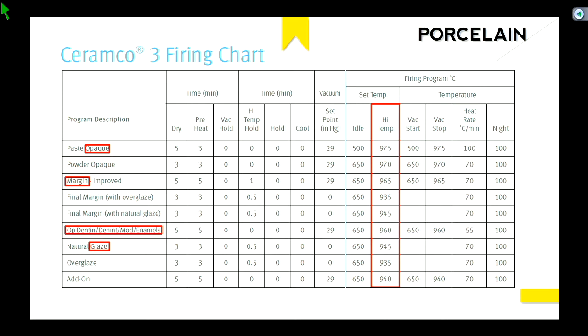If your temperature never reaches the sintering temp of the opaque layer, then the opaque layer is going to stay more or less where it's at. So as you fire multiple layers, you have to pay attention to what type of porcelain you're putting on and what the firing temperature is, because you always want to go in successive, decreasing temperature. You can imagine if you put on your last layer of porcelain and it happens to sinter at 1,000 degrees, guess what happens to all the other layers you had put on? They kind of melt away, or become liquid again, and change shape in the oven. The idea is that whatever you had already sintered, because when you mix the powder and liquid and put it in the oven it gets hard, you want it to stay there. You don't want it to slump or change dimensions as you put on more layers.